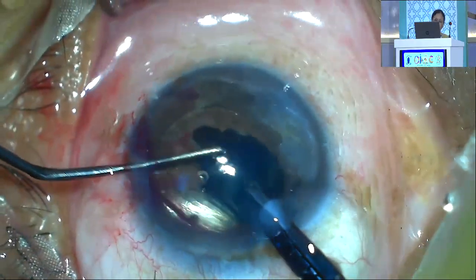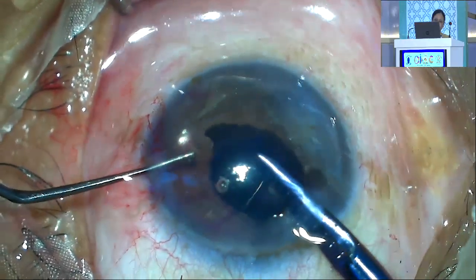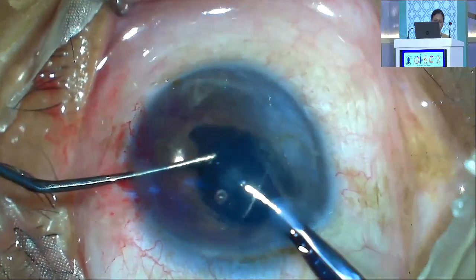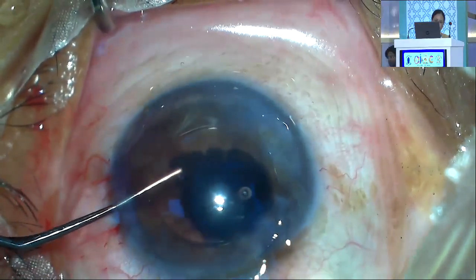Now an attempt was made to bisect the optic with the same IOL cutter. After injecting viscoelastic, the main incision was enlarged.